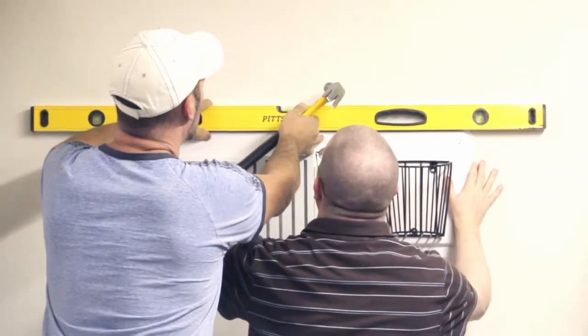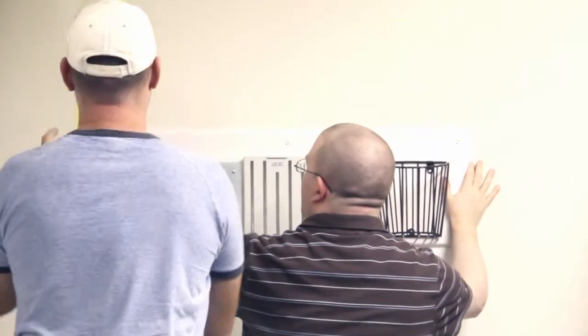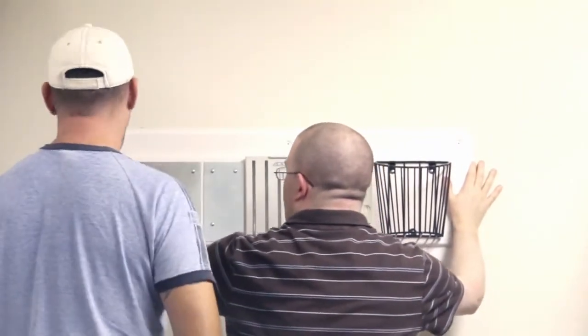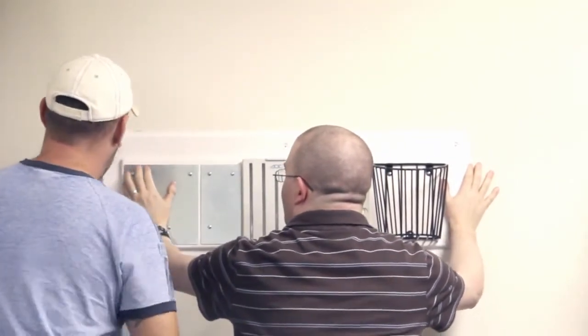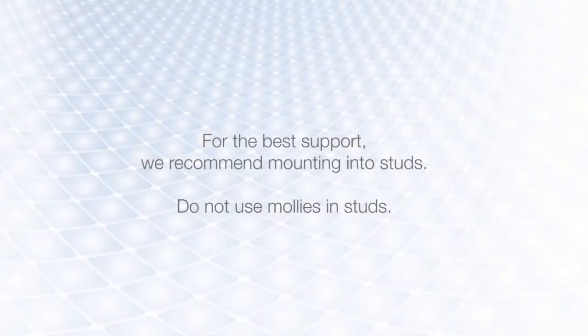Use the level to ensure the wall board is straight. Keeping the wall board level, mark each hole. You can use a nail and hammer to gently start the holes for your screws.